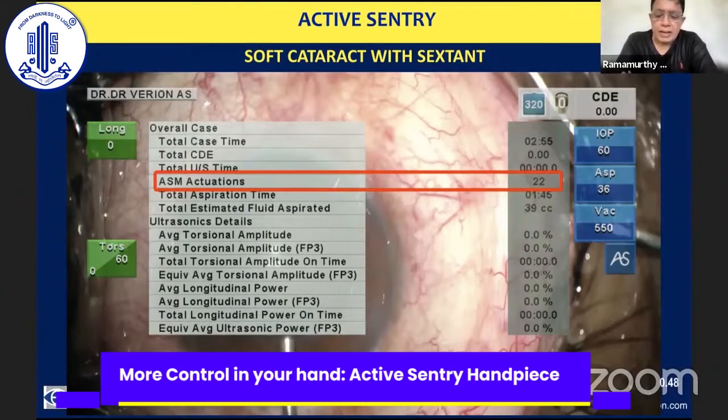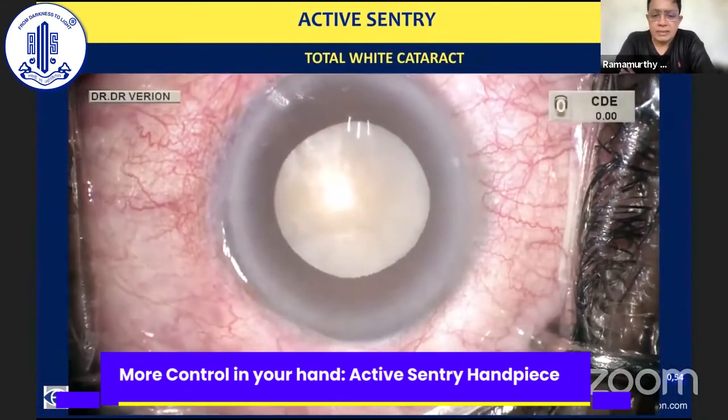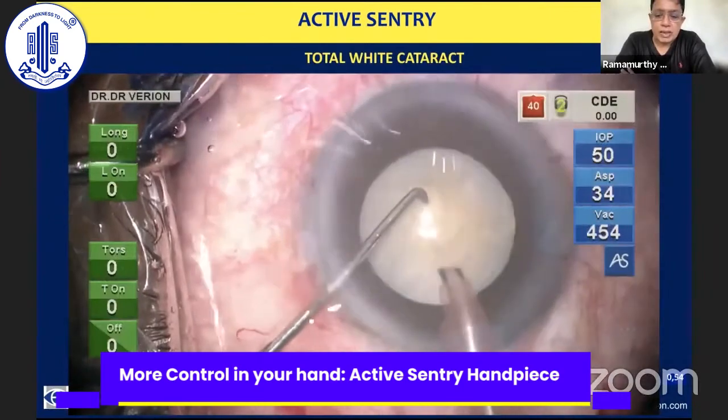When you are dealing with a harder cataract, because we are quite comfortable with the usage of the foot pedal, we fluctuate between the foot position 2 and foot position 3. And as was discussed earlier, very often we avoid complete closure, complete occlusion. But when it comes to softer cataracts, where the nucleus fragments completely flow into the tip of the needle, there is more chance of occlusion, and that is when you find that this kind of active sentry actuation is more often seen. What about a total white cataract situation like this?